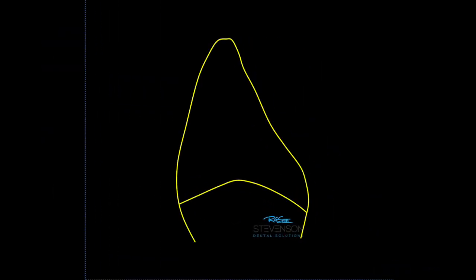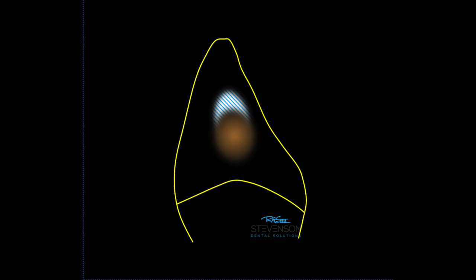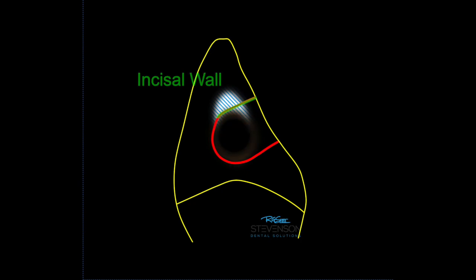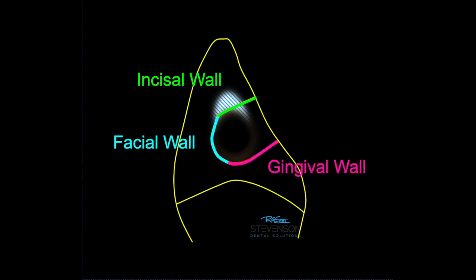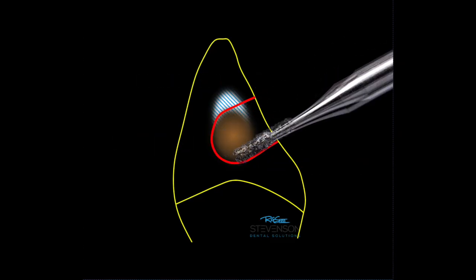Let's take a look at the design of this preparation. The contact area is present here, and the caries is occurring below the contact and up into the contact. This is the shape we're looking to do — it removes the caries yet leaves the incisal contact present. There's the incisal wall, the facial wall, the gingival wall, and of course the axial wall, where you're going to find most of the caries. We want to keep a 90-degree exit angle, with the preparation going in and sweeping back out.